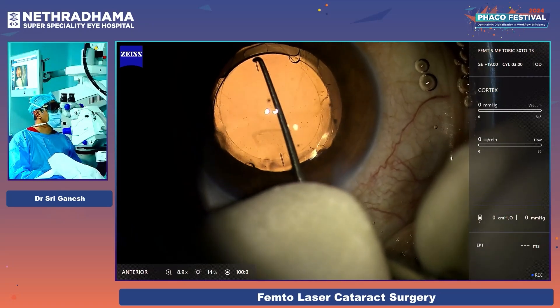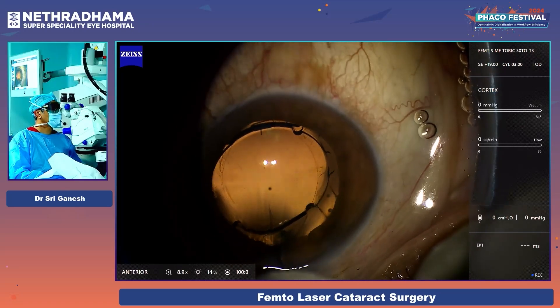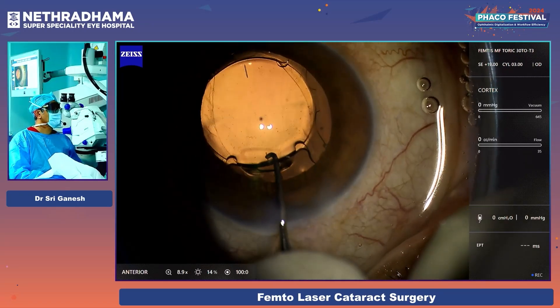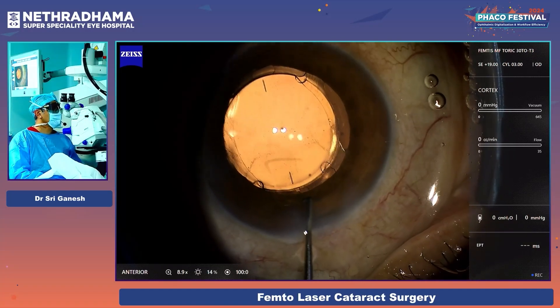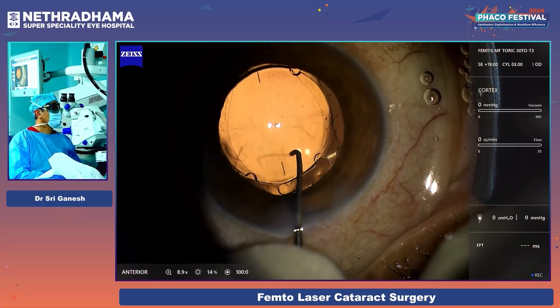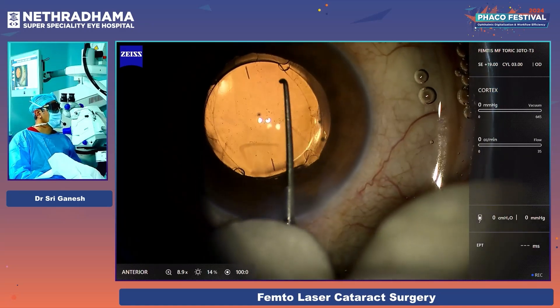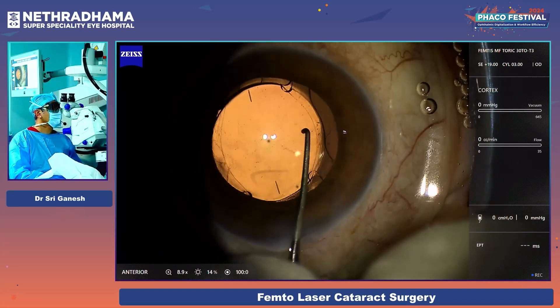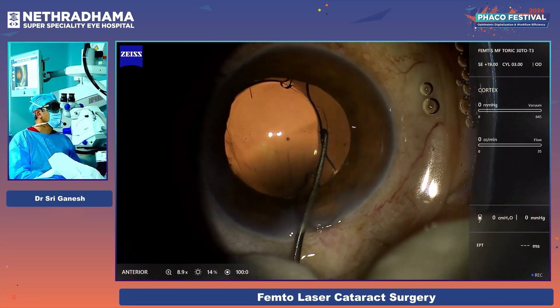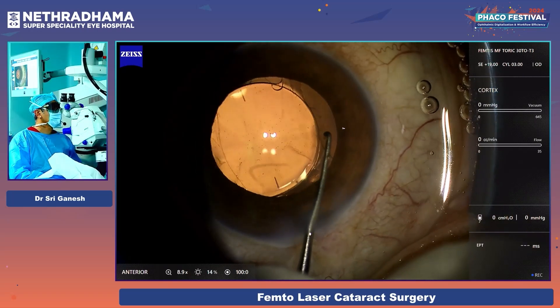You can see it is enclavated there exactly. Then I enclavate this part again — it is enclavated. Sometimes it may capture the iris, especially if you have a smaller pupil; you can just push it down slightly. You can see that I have done two enclavations. Then enclavation of the side — that is also enclavated.